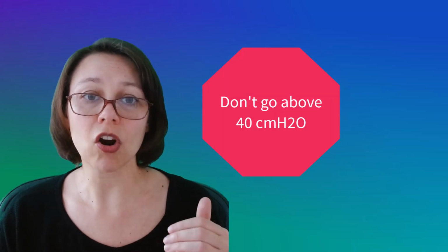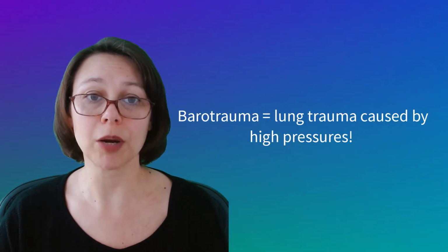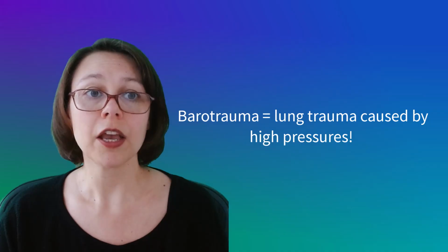You should also have a hard limit of about 40 for most patients. Higher than that, and you may be risking barotrauma, which is trauma to the lungs caused by high pressures. It's going to alarm when the inspiratory pressure reaches that set point, and it's also going to end inspiration and cycle into expiration.